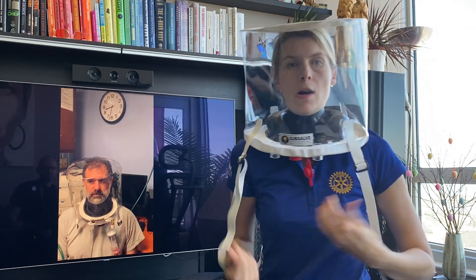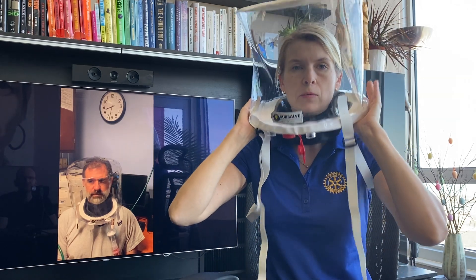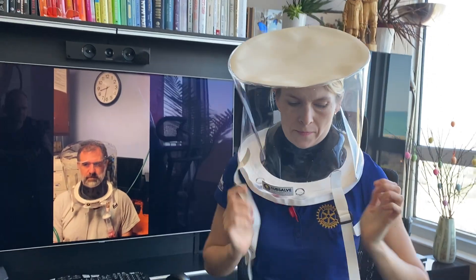This strap goes under your armpits, and from the pressure the helmet will rise up a little bit, which will hold it in place. It can be adjusted based on the patient. I am going to take this off now.